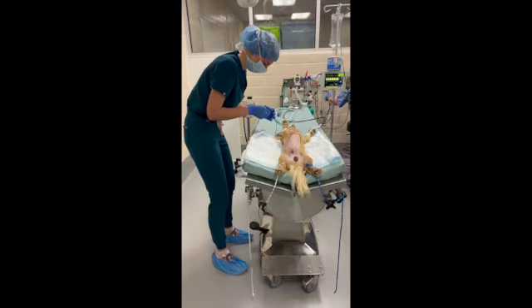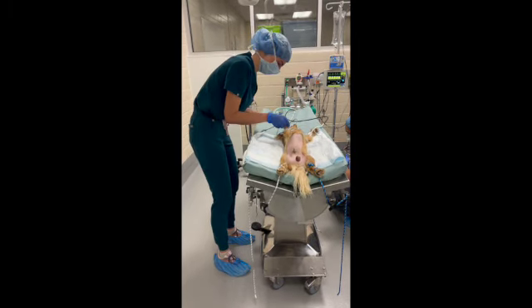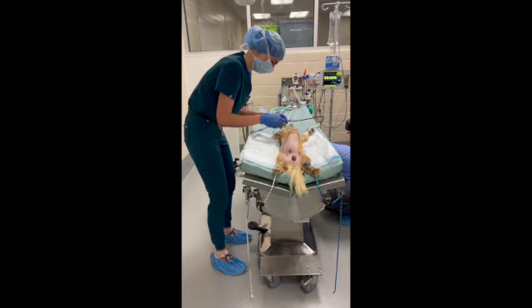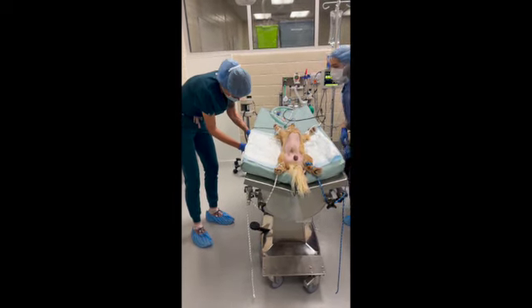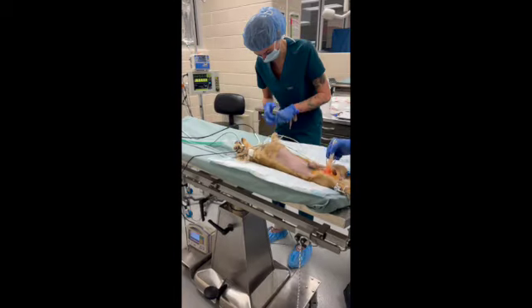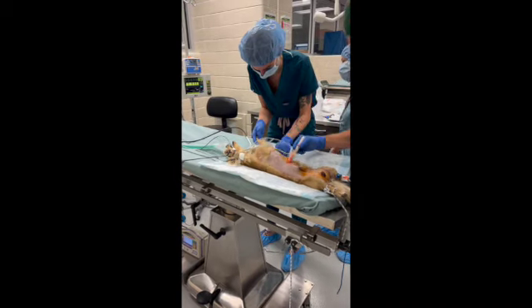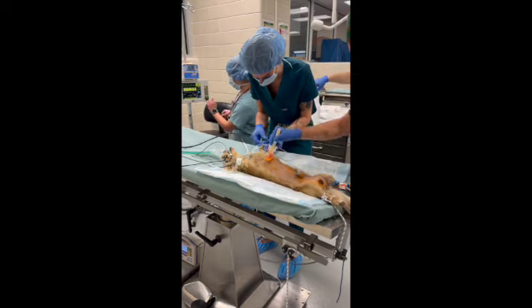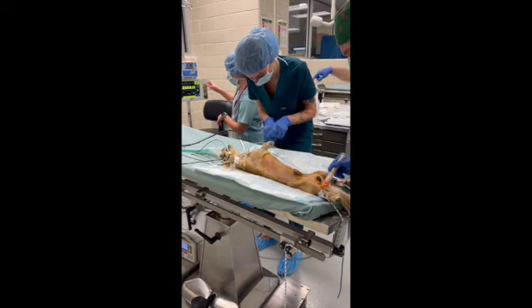Good job. Go ahead and finish getting the rest of your monitoring hooked up, blood pressures and all that. And then get your Cerenia when you can. You can do it pre-op. Yes, I need that sheet. And that sheet. I just undid it. I'll reattach it in just a second. Top right corner of the button. Oh, this one. Yeah. Thank you.